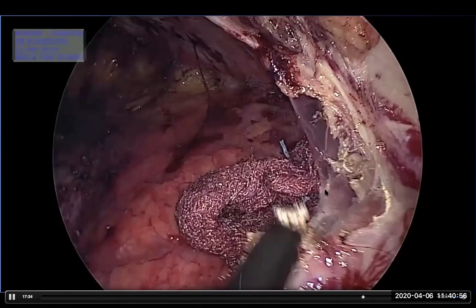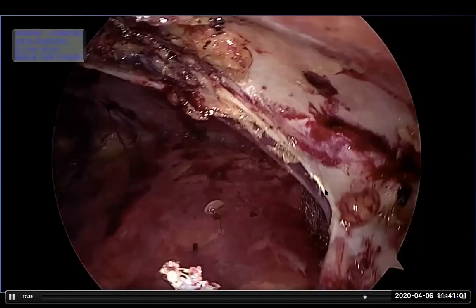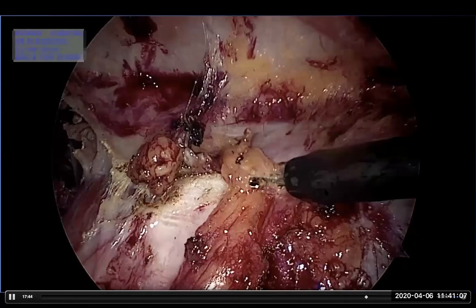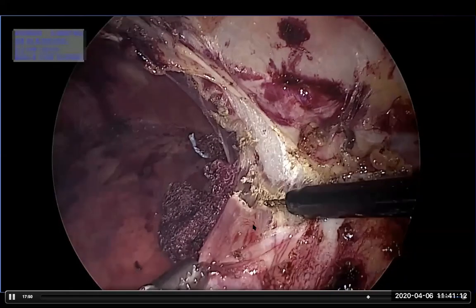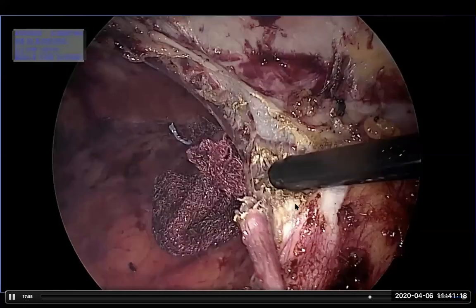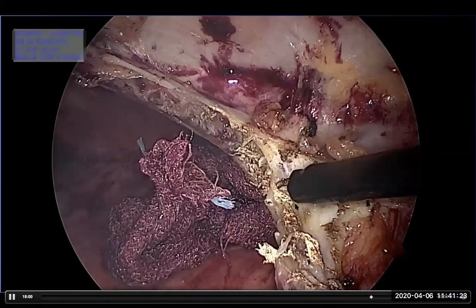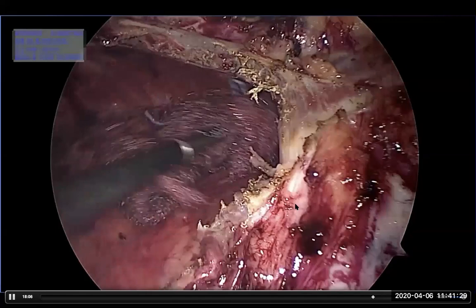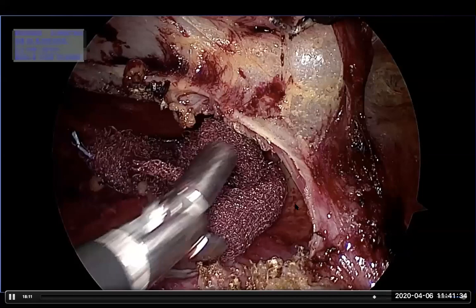That is the TAR. Now you see that we are sweeping the peritoneum off the undersurface of the transversus and going bit by bit. Now very, very clearly you can identify the posterior lamella of the internal oblique is this one. Underneath is the transversus muscle. Going fiber by fiber, bit by bit. This is from below up. This is the bottoms up approach. The gauze piece is immensely valuable. You can roll it like a cigarette. That is also another way of doing it. The robotic surgeons do it that way as well.